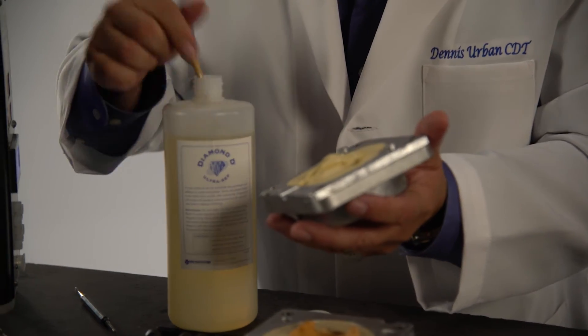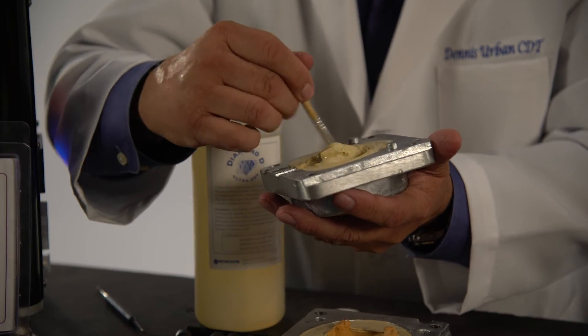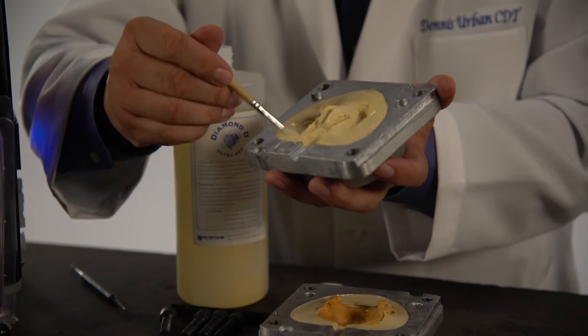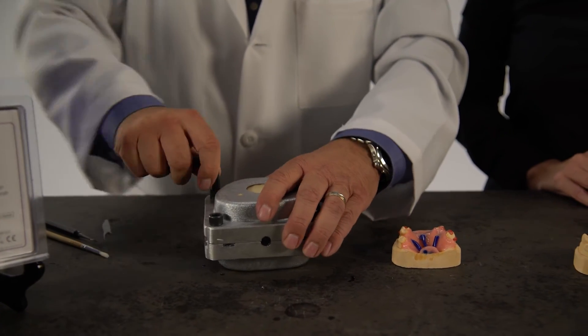After the case is boiled out, apply one coat of Diamond D Ultra-Sep to all gypsum areas. Allow separator to dry, and then close and screw bolts into the flask.